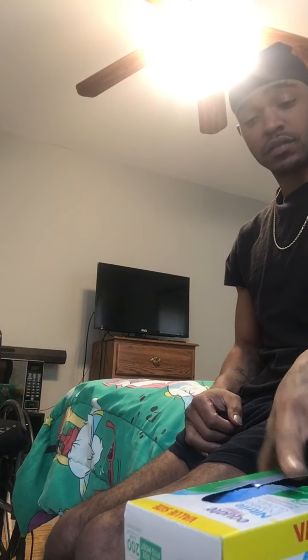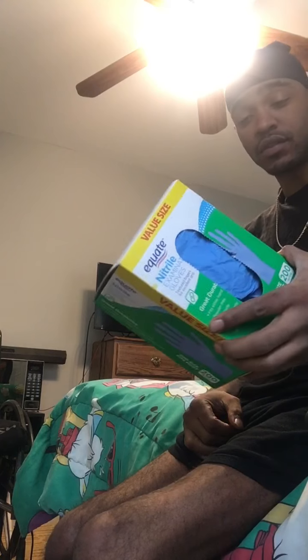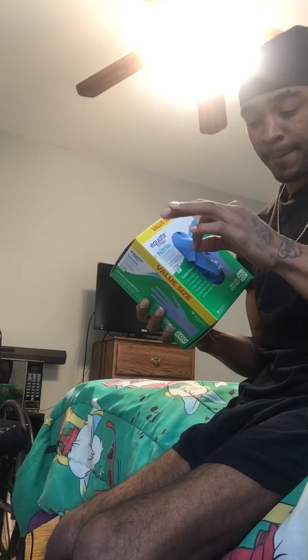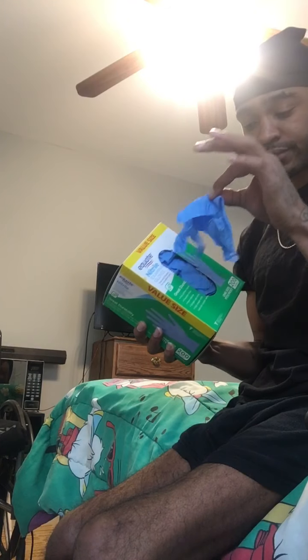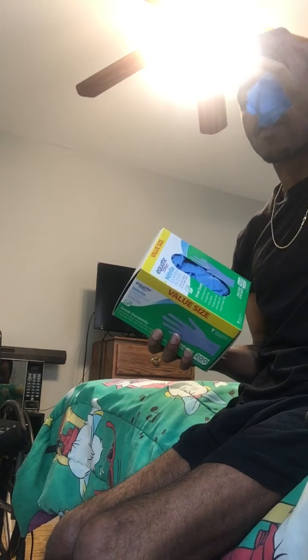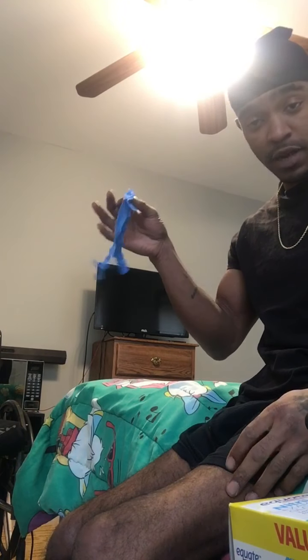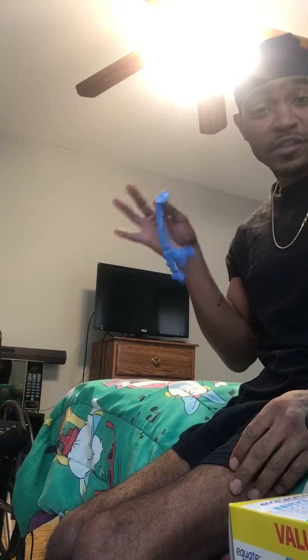So with the gloves — these are the gloves I use. The only thing I do is grab a glove making sure I don't grab it by the fingertip. Here's my glove. I haven't touched anything.